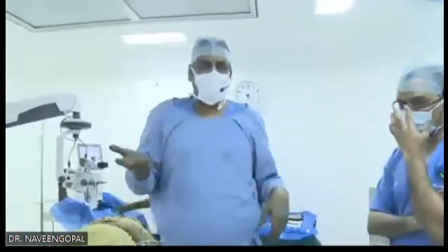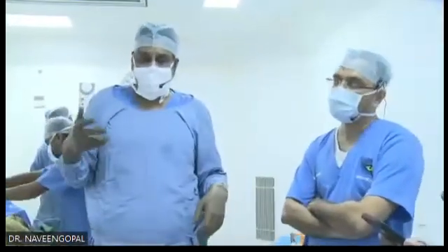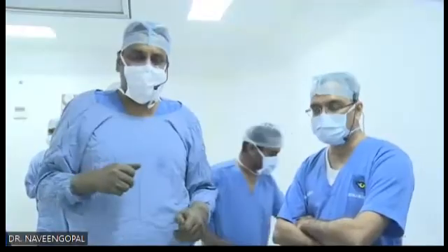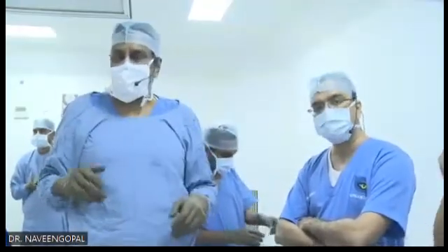Any questions on multifocals or anything, I'm happy to answer. Basically, I'll tell you how to choose a multifocal. Usually multifocal I choose in patients who don't drive in the night, especially. Occasional driving in the night is okay. And astigmatism should be less than 1, or else I go for toric multifocal. Below 1 is ideal for your normal trifocal or multifocal.